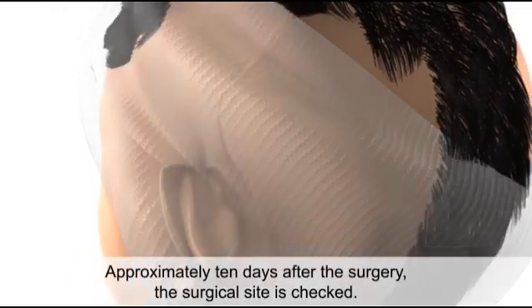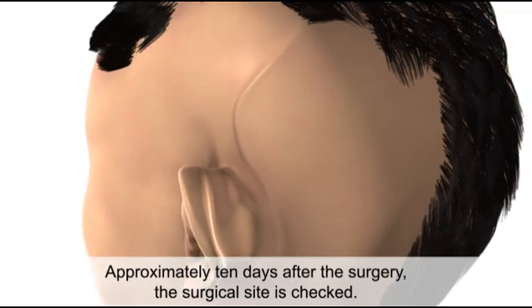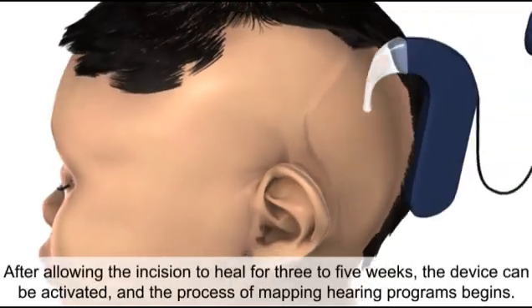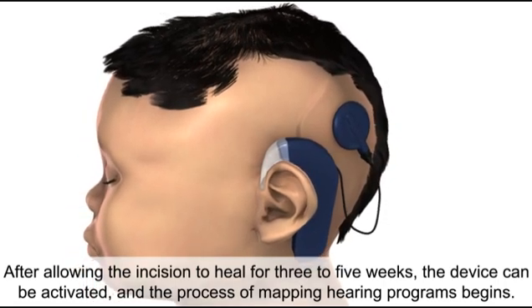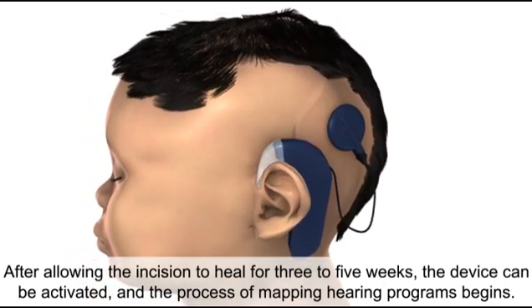Approximately 10 days after the surgery, the surgical site is checked. After allowing the incision to heal for 3-5 weeks, the device can be activated and the process of mapping hearing programs begins.